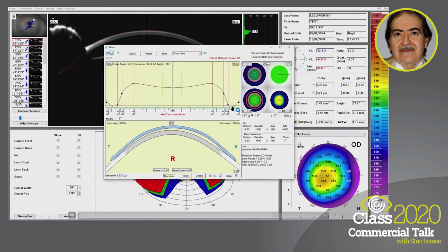Right, so now we have a nice semi-scleral lens touching at this point of the cornea and this point of the cornea. You can do anything you want with this lens. You can move the edges up and down. You can move the sag higher and lower. You can reduce the OZ, you can increase the OZ. So everything you can manipulate.